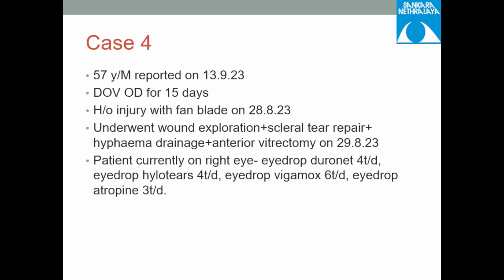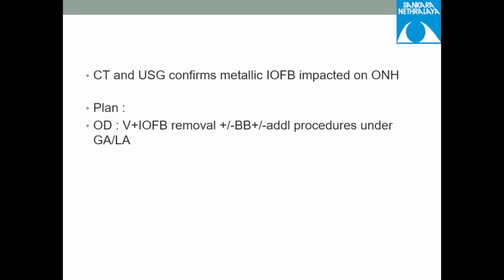Do you need to do an ultrasound when you can see the foreign body clinically? Yes or no? How many people would like to do it? Raise your hands. How many no? Okay. If you want to do it, why? You can see it clinically, right? And the depth of the foreign body, whether it is impacted or not, you can ask the patient to move his eyes, and you can see with your IDO whether the foreign body is moving or not.